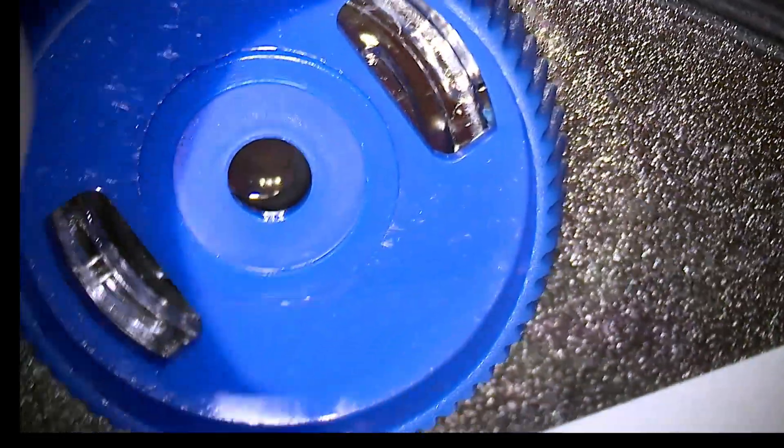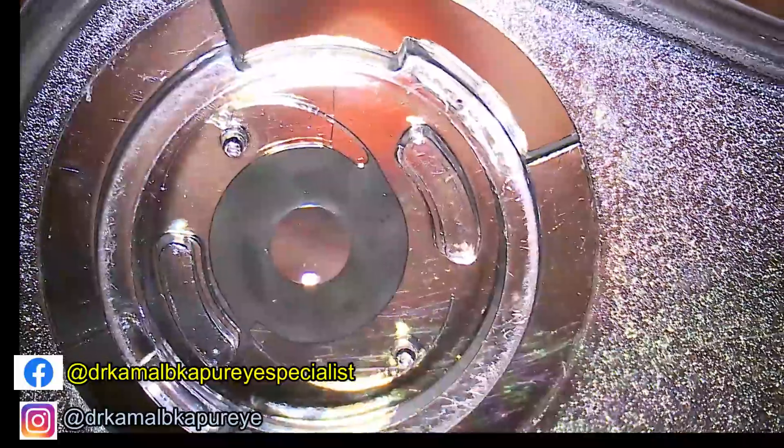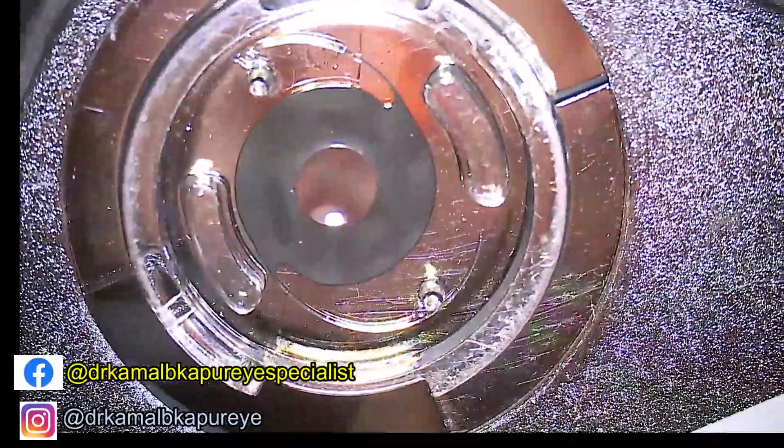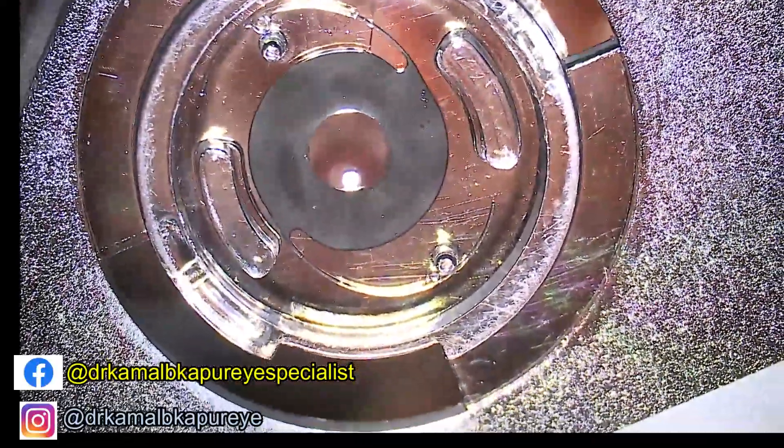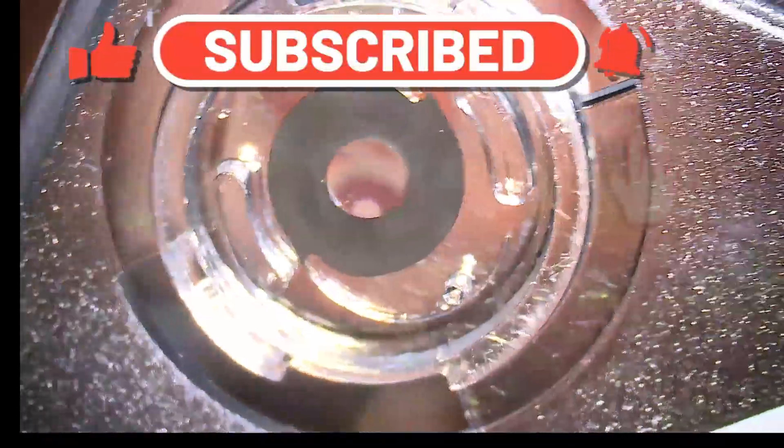This is a case of aniridia with high myopia. You will see this is a 12 diopter aniridia lens. We've got it custom made for this patient — the total diameter of the IOL is approximately 11 millimeters.